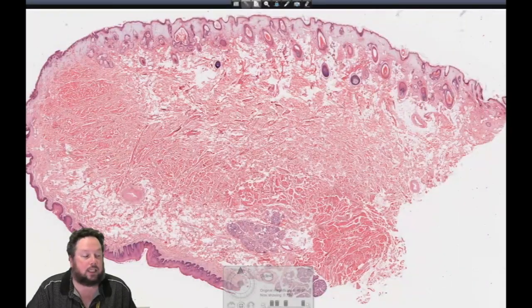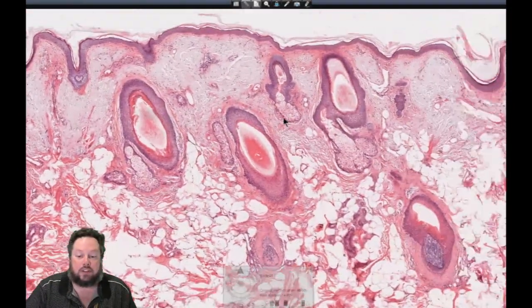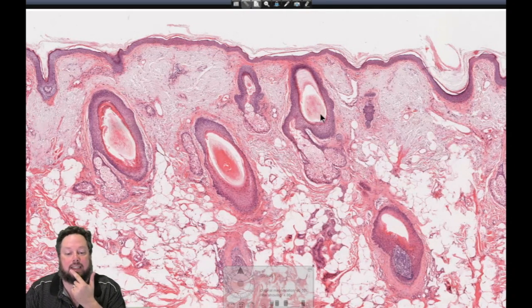So we're going to start off today with looking at the lip, which is of course the border for the oral cavity. So this is a low magnified section here of the lip. We can actually see these sort of strange structures on the outside here. This is actually the outer part of the lip, this sort of hairy part here.